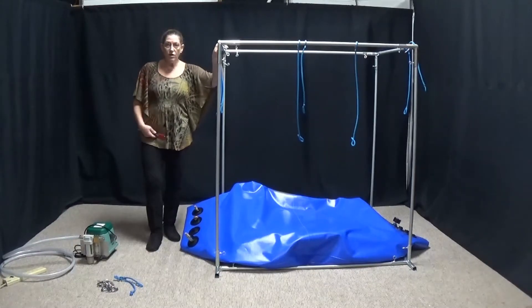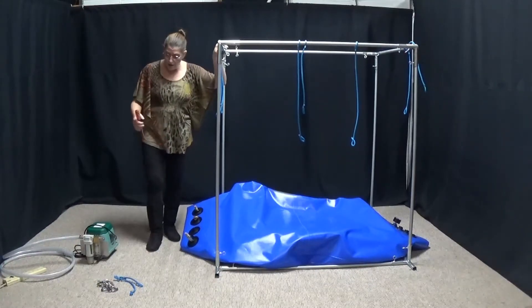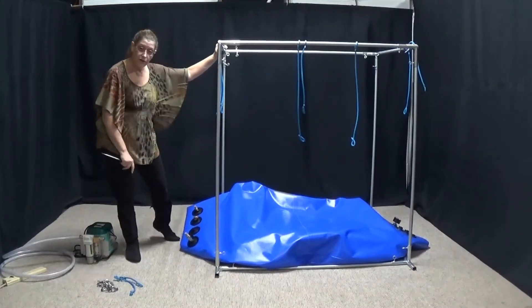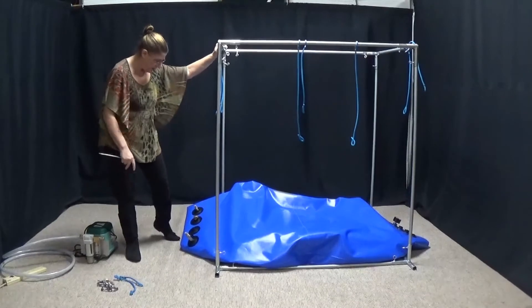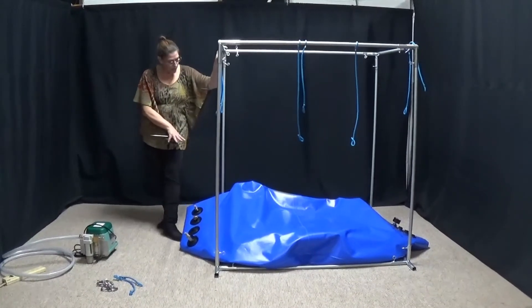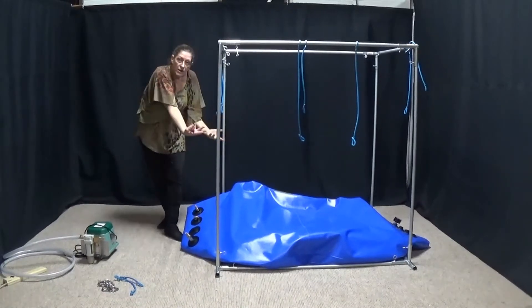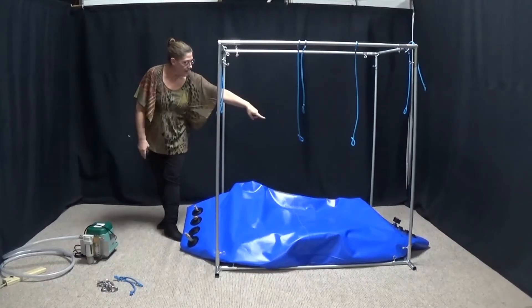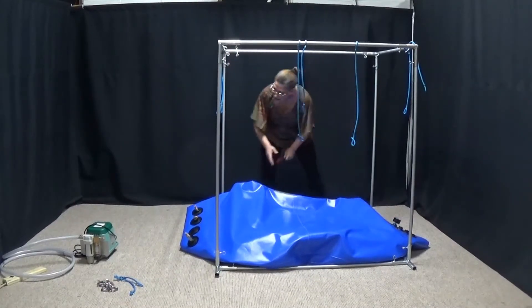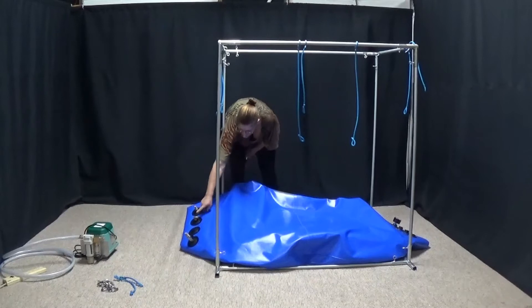Now we're going to go ahead and start dealing with the chamber. I've got my quick links, my two short bungees left over from my kit, and I've laid out my chamber. You'll see the picture in the manual. All the folds for the chamber are underneath, my gauge is on this side, and my air intake is on that side.